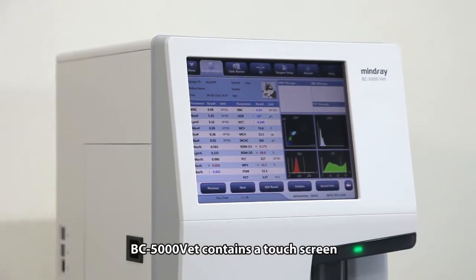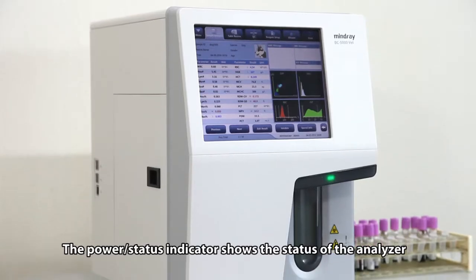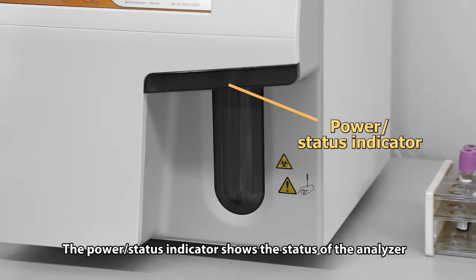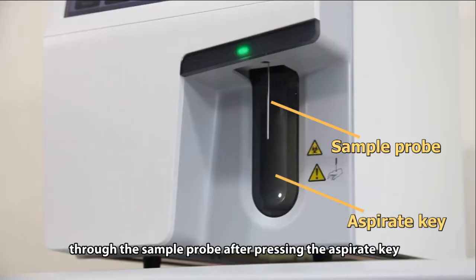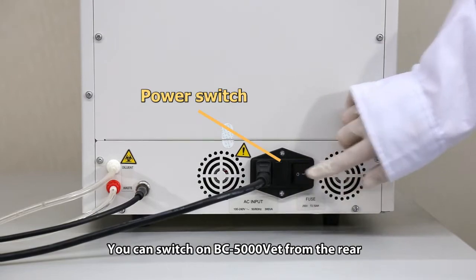BC 5000 VET contains a touchscreen with user-friendly software. The power status indicator shows the status of the analyzer. The user can load the sample through the sample probe after pressing the aspirate key. You can switch on BC 5000 VET from the rear.